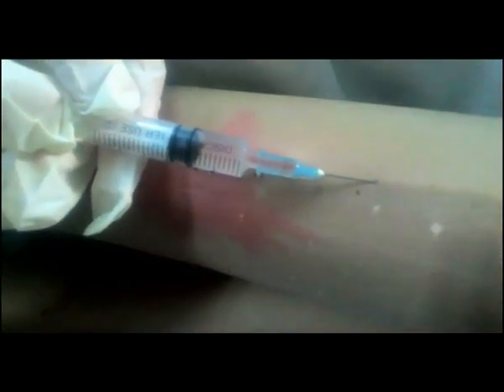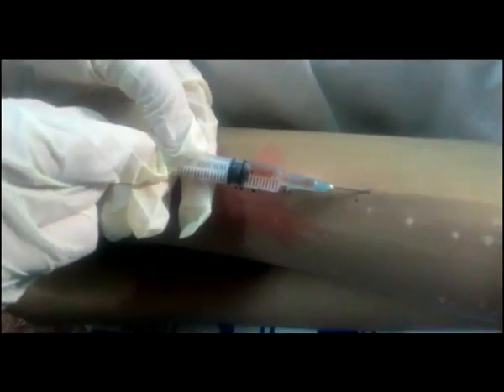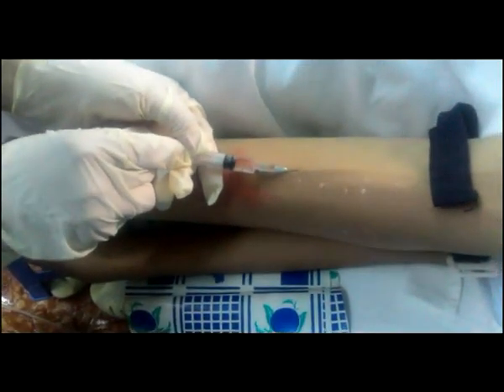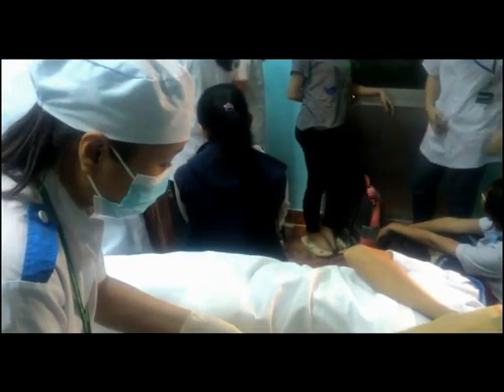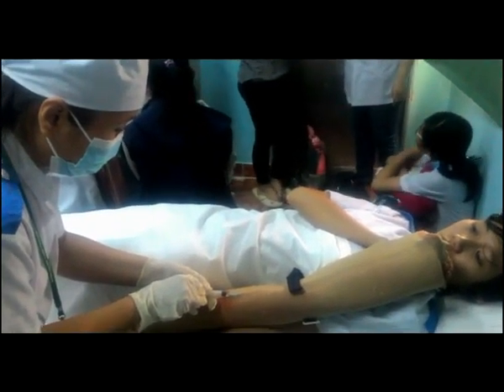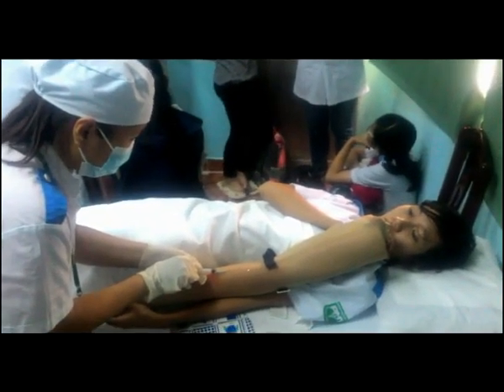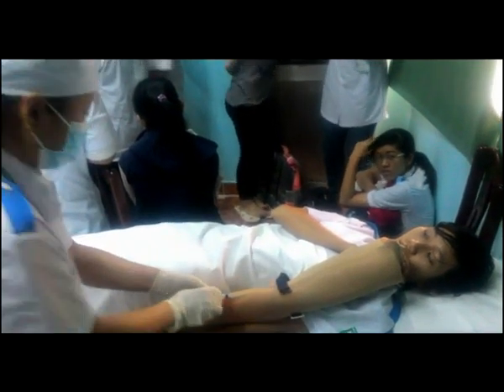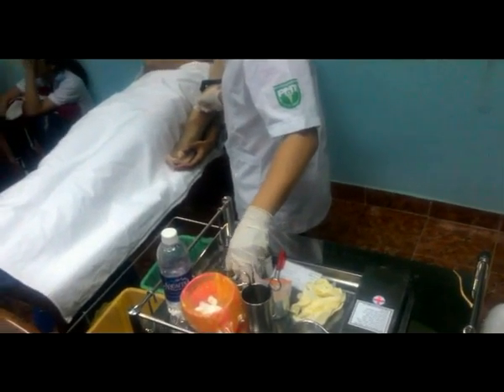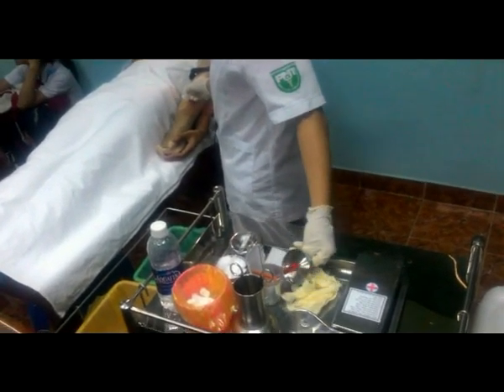Sau đó mở dây ga-rô và dặn bệnh nhân buông tay ra. Bơm thuốc vào từ từ, đồng thời quan sát nét mặt bệnh nhân. Bơm hết thuốc, dùng gòn khô ấn nhanh vào vị trí và rút nhanh kim ra.